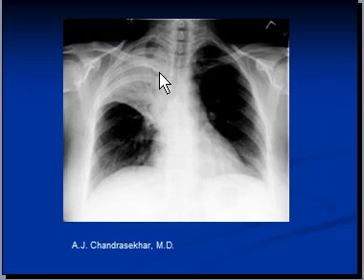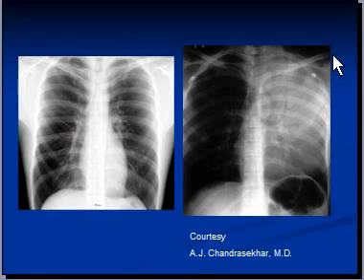This example shows consolidation of the right upper lobe, and you can see an air bronchogram through the consolidated lung. In consolidation, the bronchi of the lungs containing air are often clearly visible through the consolidated lung, including branches that would normally be difficult to see.